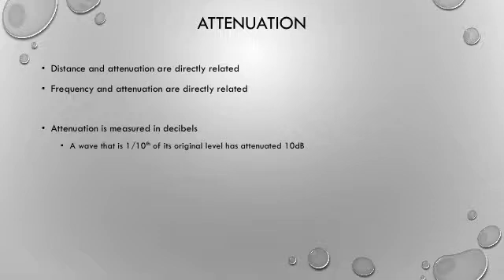So other names that this goes by. Again, this becomes kind of that memorizing the new language sort of thing. Penetration depth, depth of penetration, same thing. Half boundary layer, okay? That's what they call the half value layer, the half boundary layer sometimes.